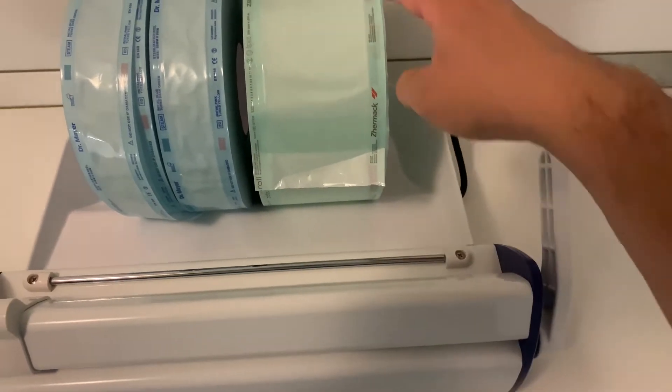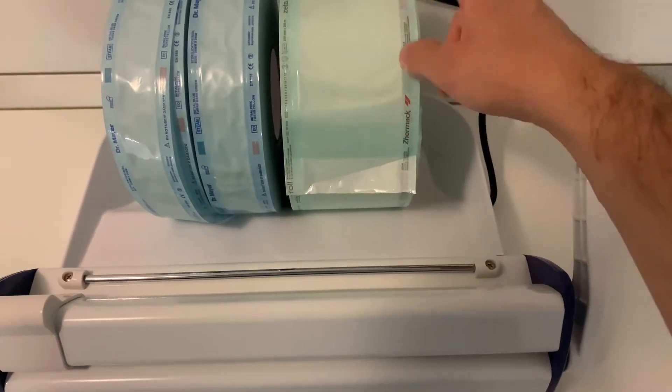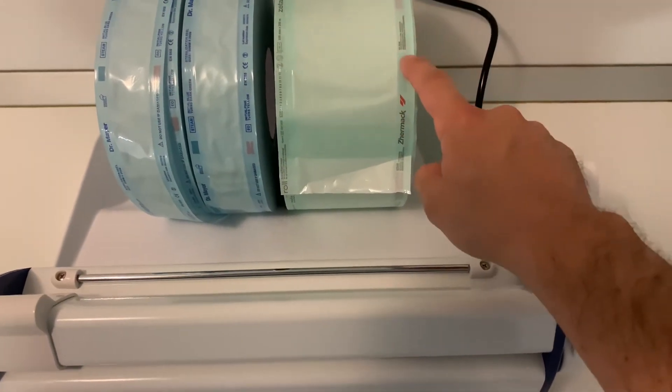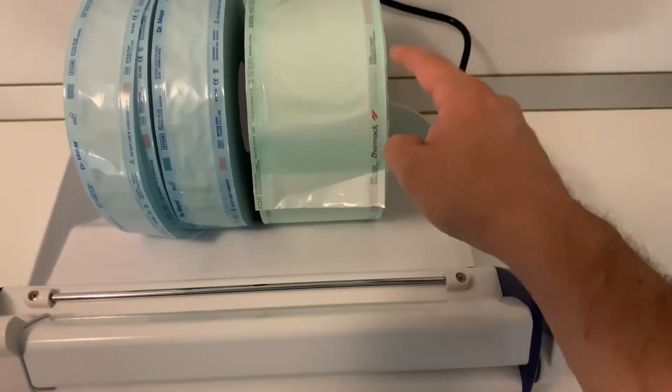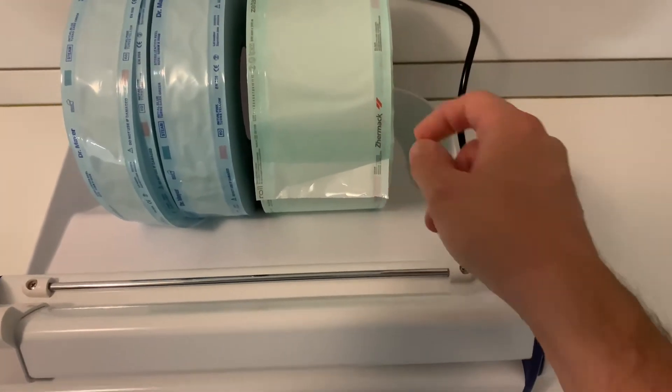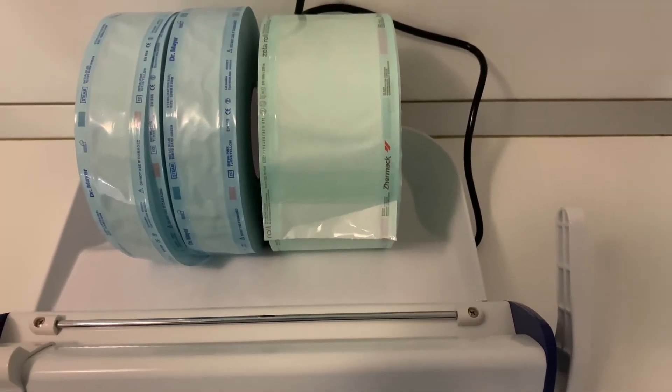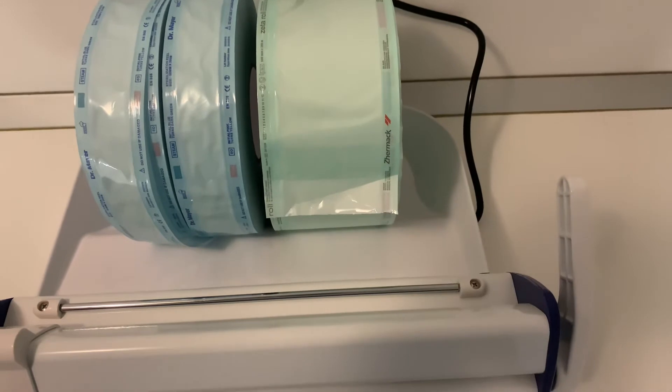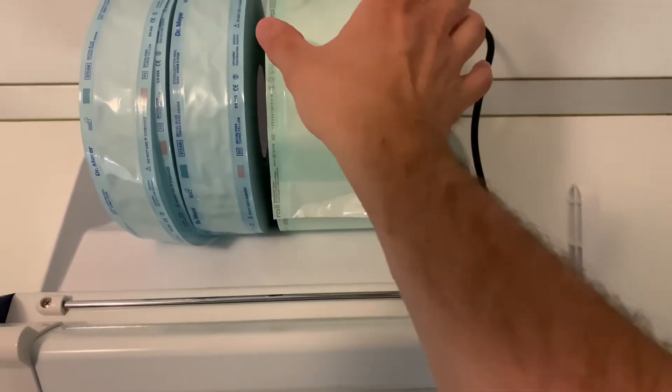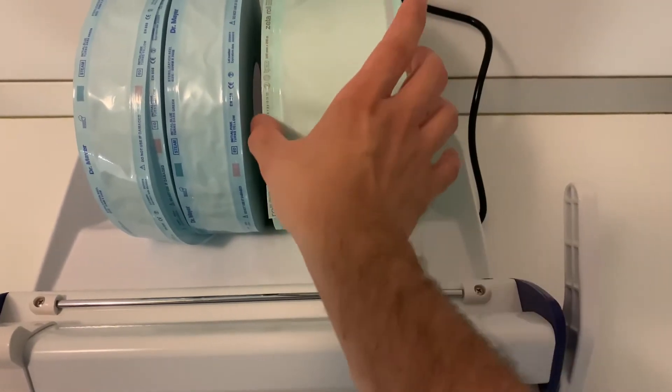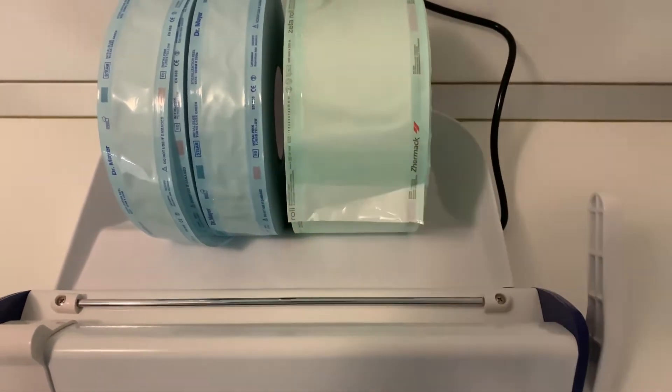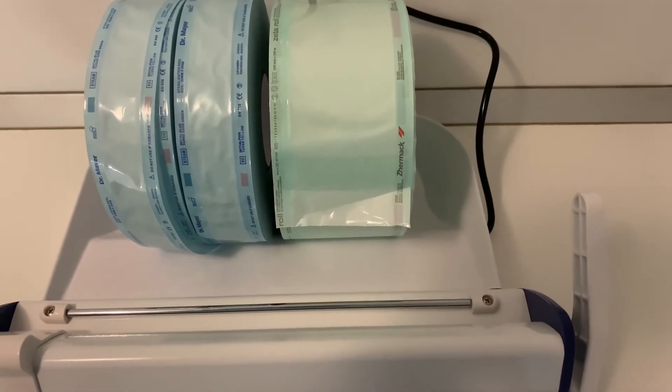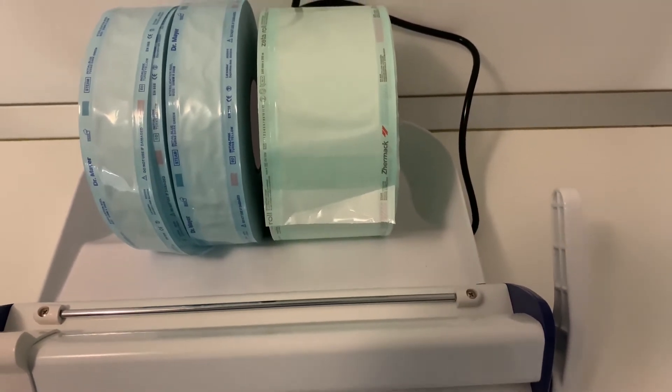It includes sterilization indicators both for ethylene oxide and for steam sterilization. The margins have a triple seal to ensure high quality sterilization.